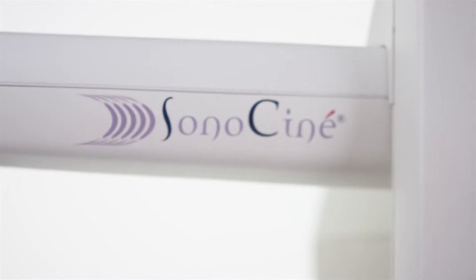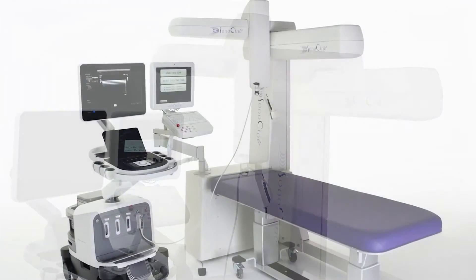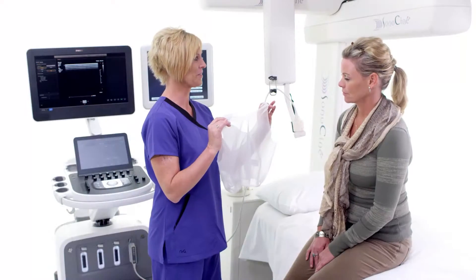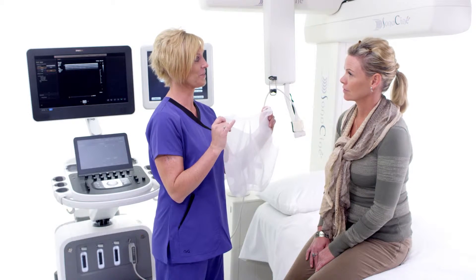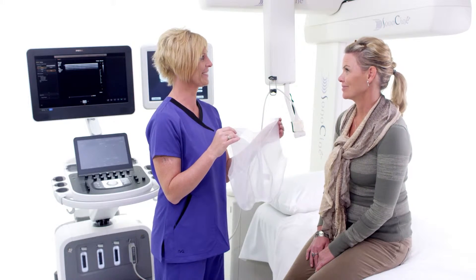The SonoCine AWBUS and the ultrasound machine work together to capture thousands of high-resolution images of your entire breast — your whole breast. You'll be asked to wear our proprietary, custom-designed AWBUS camisole, not available in stores. Though it may not win any fashion awards, it fits like a sports bra and keeps the girls in place to allow for the best imaging possible.